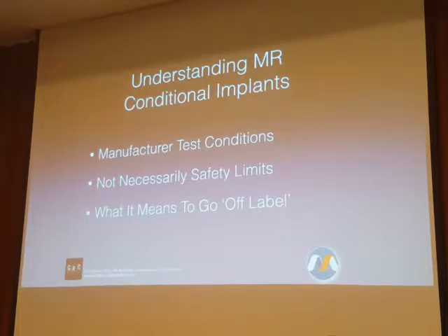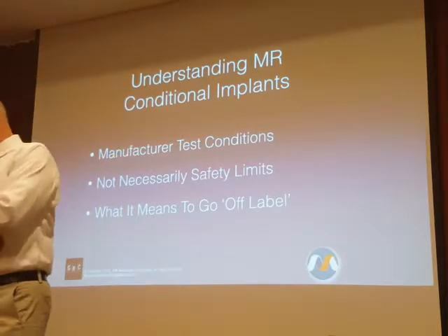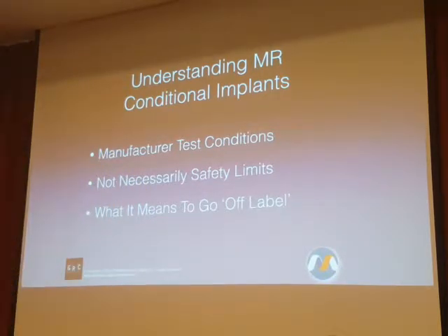And similar to what I just described, the test for spatial gradient is you take the implant or device, you set it inside the magnet hanging from a string, and you measure the angle at which the device is pulled towards the magnet. And you put the test in a specific position where you know what the spatial gradient is in that location.